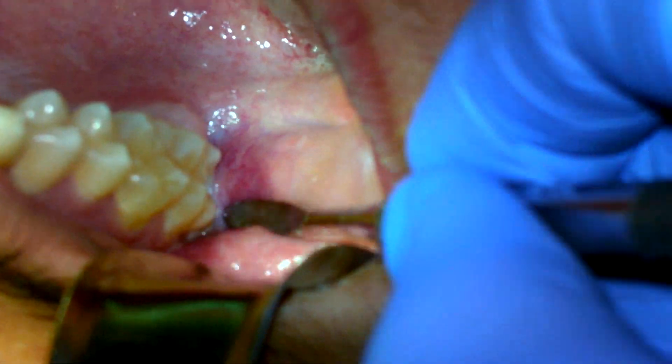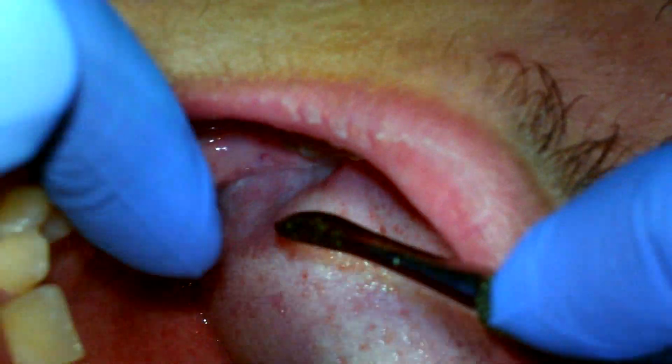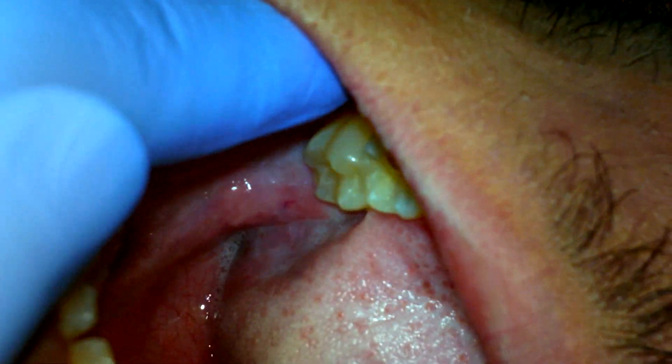My name is Dr. Kambes Sedray and today we're doing wisdom teeth surgery. This presentation is for general dentists only. If you're a surgeon, you should already know how to do this.